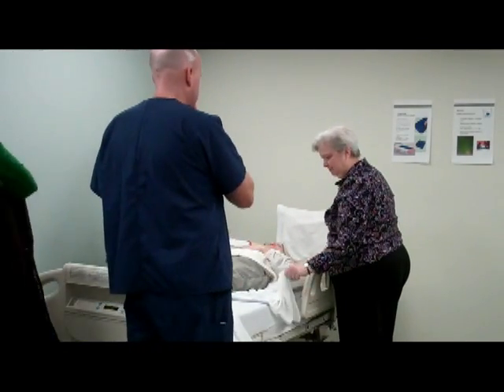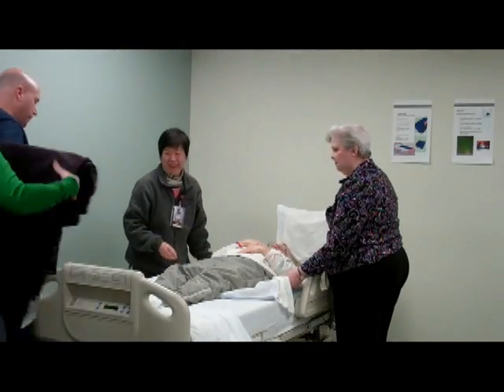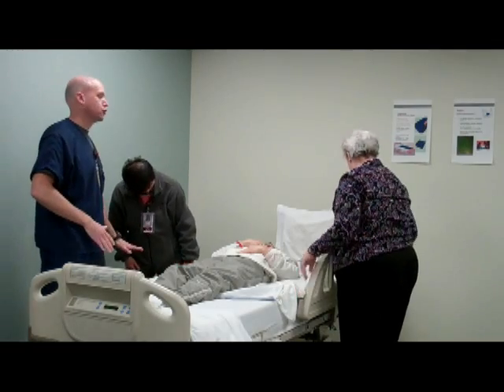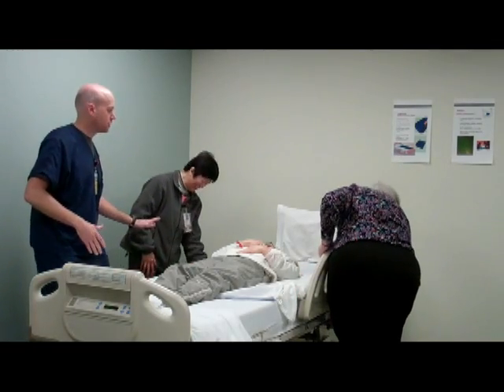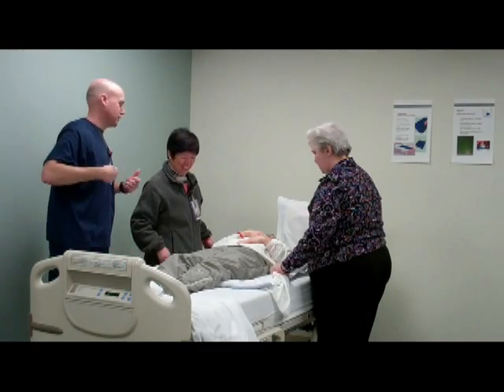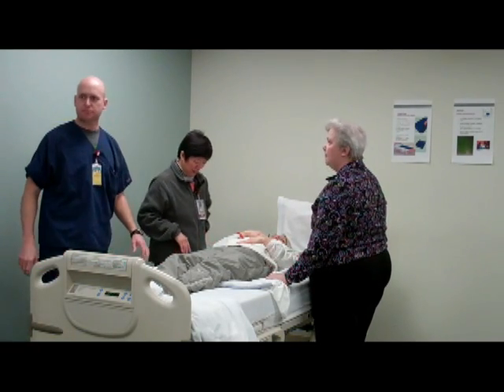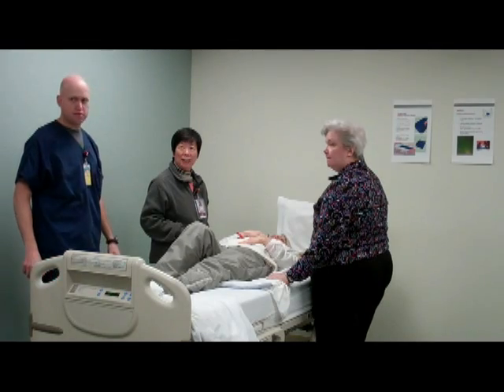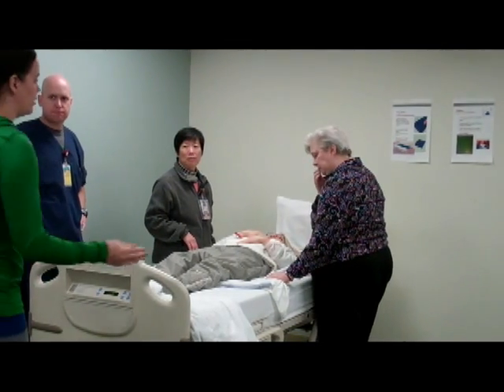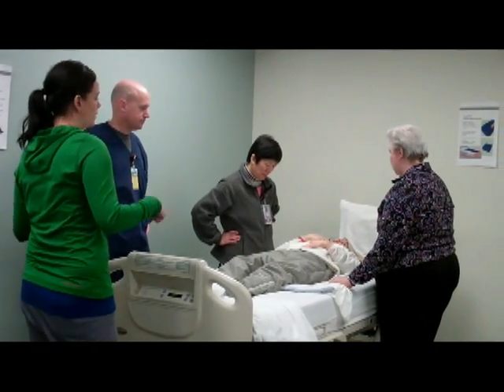One other thing we didn't address was when you're boosting your patient, make sure that you get the bed at about hip level. Now, if you're taller like me and there's a shorter person, it's at the shorter person's hip level. The taller person probably needs to get down, but we don't want Sue getting up on her tippy toes or jeopardizing her back by getting in a bad position, right? So, side rails always down. It doesn't matter how short they are. Even something that's an inch higher than the bed that you have to reach over and leverage your body over is going to hurt your back.